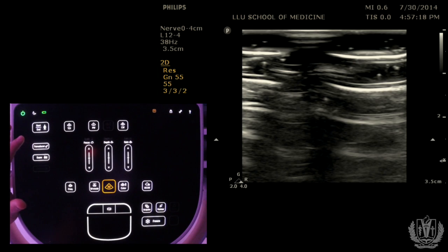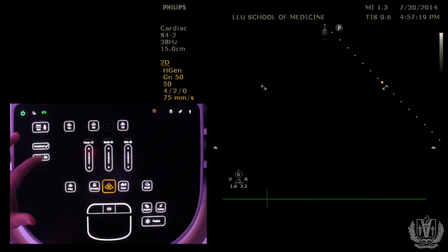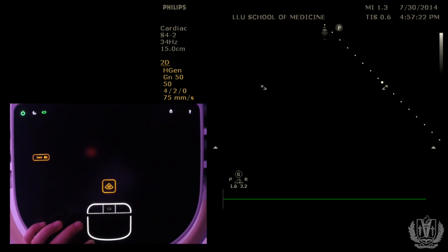If we switch back to the phased array probe and go to the EXAM menu, you can see options including abdominal, cardiac, pelvic, fast scan mode, lung, and additional ones. The main ones you're going to use are probably abdominal, cardiac, and pelvic.